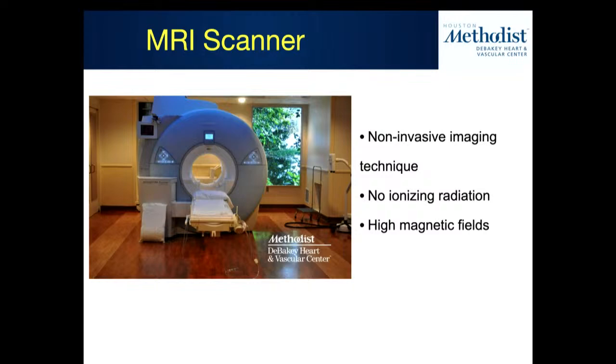First off, here's an MRI scanner. We don't have this scanner any longer. This was the first scanner that we got when I first started here at Houston Methodist with the CMR program in 2008. And this was a Magnetom Avanto scanner, which was a 1.5 Tesla scanner.